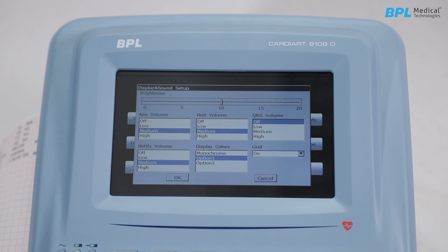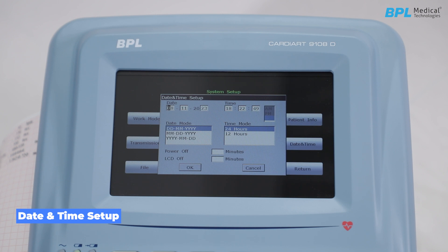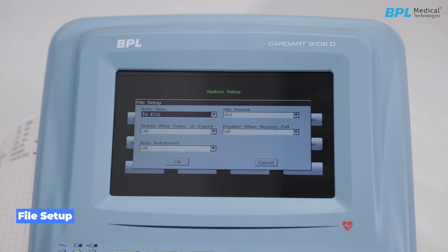The grid option displays the waveform with a background grid. In date and time setup, input the date and time when using the ECG for the first time. Power off and LCD off time can be set for automatic power-off when keys are not pressed. In file setup, auto save has three options: save to the machine (ECG), save to external USB memory, or off (do not save). File formats available are DAC and PDF by default; SCP, FDA, and DICOM are enabled only on request at purchase. Delete after transmission or export can be enabled. The machine memory capacity is 800 ECGs, with a replace option when memory is full.